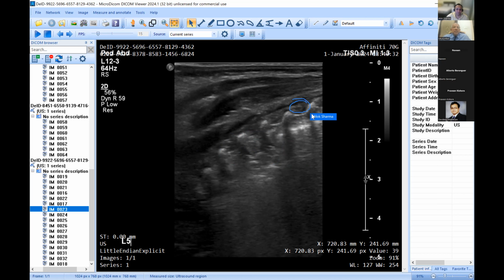Okay, so that's a rib. That's a rib. That's a rib. To make it a little bit easier for you, it's a little bit tricky because, coming back to Naveen's scan, the challenge of doing L5 is that it's at the back. Maybe the baby's arching a little bit, and you've lost some of the perpendicular nature of the scan, which makes interpretation difficult. But those are ribs. So it's difficult to see a batwing sign clearly, but if you take it with an eye of faith, that's a rib, that's a rib shadow, that's a rib, that's a rib shadow. So technically, this should be a batwing sign in between. Does that make sense?